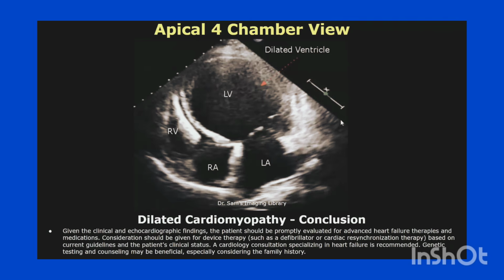Given the clinical and echocardiographic findings, the patient should be promptly evaluated for advanced heart failure therapies and medications. Consideration should be given for device therapy, such as a defibrillator or cardiac resynchronization therapy, based on current guidelines and the patient's clinical status. A cardiology consultation specializing in heart failure is recommended. Genetic testing and counseling may be beneficial, especially considering the family history.